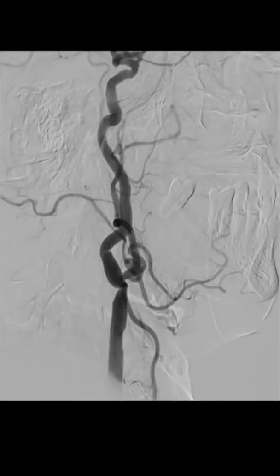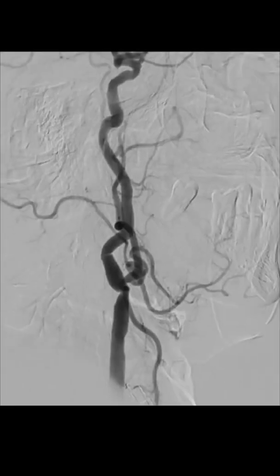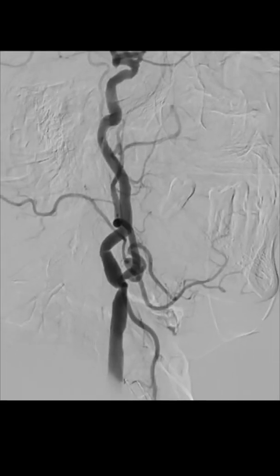We'll take one more view in an oblique view and see another view where also you can see that it has not significantly progressed. It is a very clean lesion. It is not an ulcerated plaque. There is no feature to suggest that there is a superadded thrombus in that. It's a very clean lesion. It's not irregular, and it is not a very tight stenosis also.